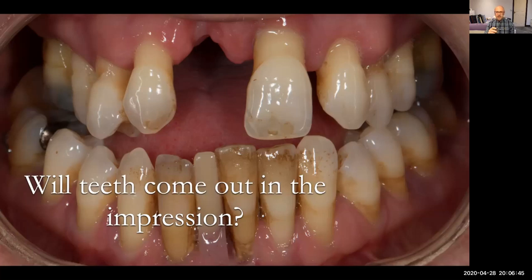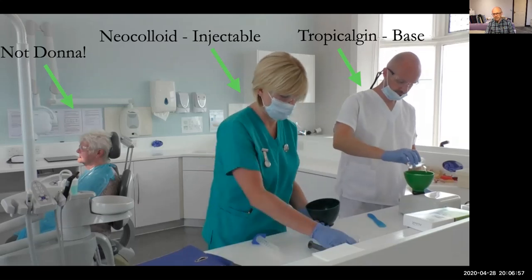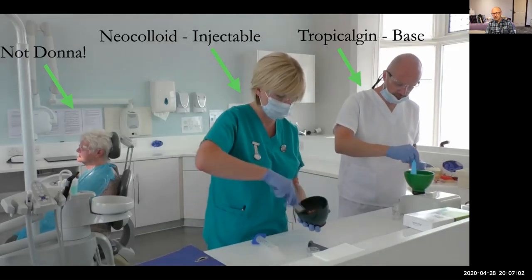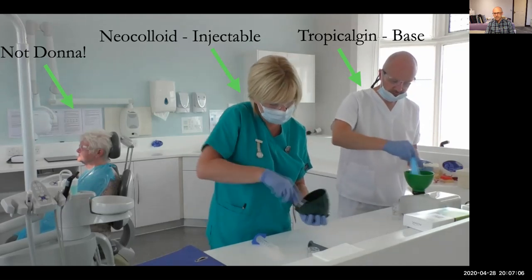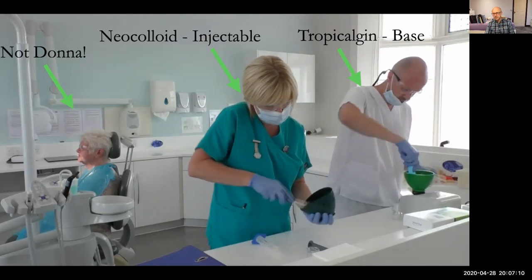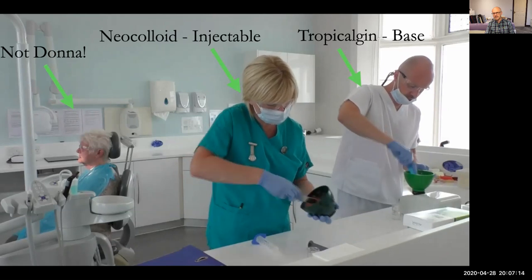So it's like I've been showing you over the past few weeks here. That's not Donna in the chair, but if you imagine that is Donna there, this is what we do. So Claire, my nurse, mixes up the runny material, the injectable neocolloid. So she mixes up that beautifully, and so as free of air bubbles as possible, and then she loads that syringe.